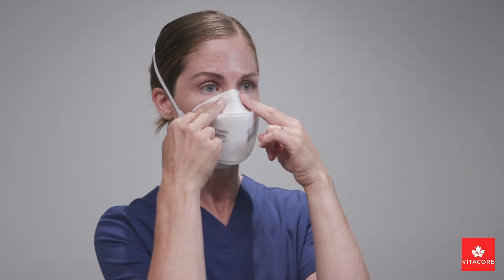Conduct a user seal check each time you don your mask by placing both hands over the respirator, covering it as much as possible. Inhale and exhale sharply. Be careful not to shift the respirator. If air is leaking around the nose, adjust the nose piece by placing it higher up on your nose bridge and pressing down to seal.